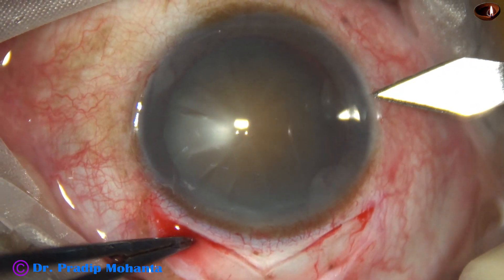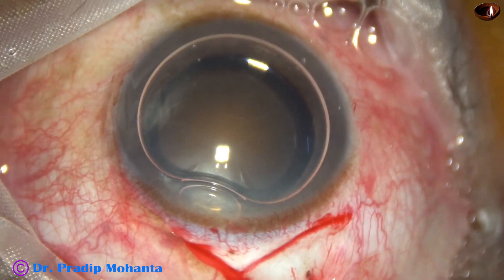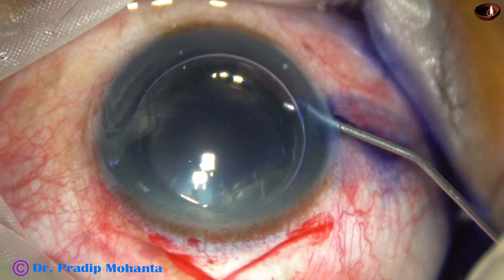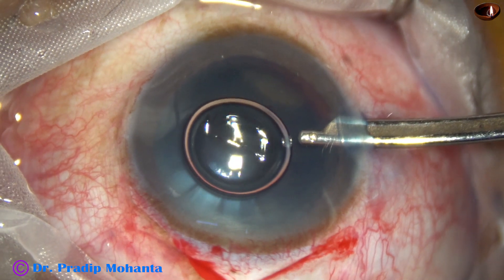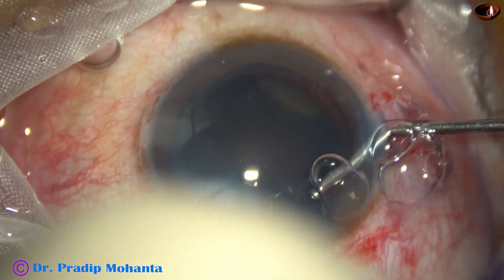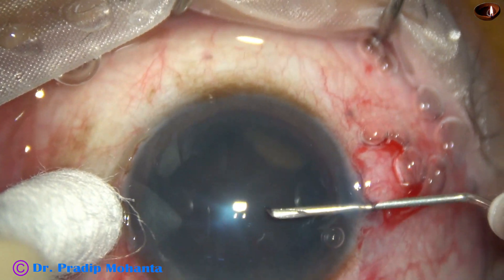Now is the time to make a side port and make an adequate sized rhexis. This is the side port and air bubble is injected. Trypan blue dye is applied over the capsule. This is a bit of adrenaline. The dye is now washed out, and there is a nice staining of the capsule just by 12 to 15 seconds of adherence. Now I am going to do the rhexis with the help of a cystitome, a 26-gauge bent needle.